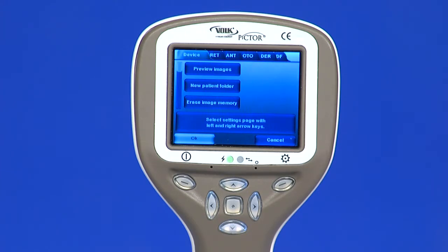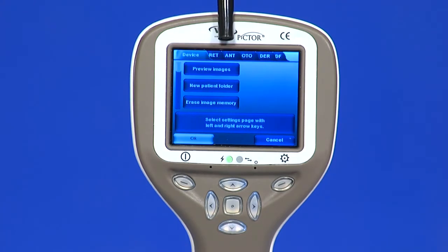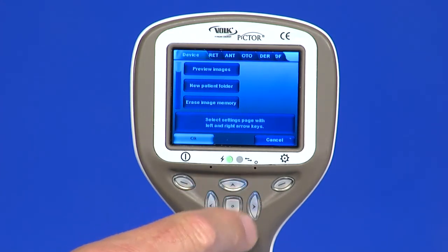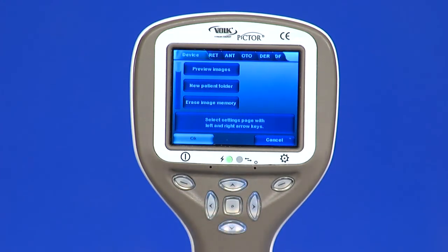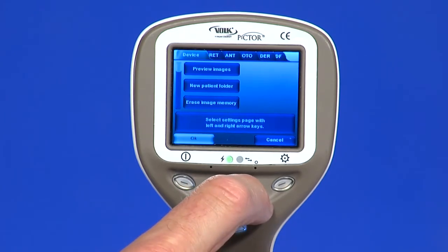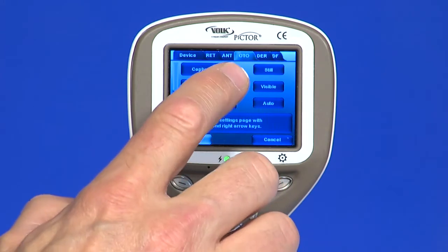The menu has six tabs. One is for device settings. There is one tab for retinal imaging, anterior eye imaging, ear imaging, skin imaging, and general imaging. The arrow keys are used to move between tabs. Use the arrow key up until the tab is active and use left and right arrow keys to change active tabs. Light blue color indicates the tab is active.